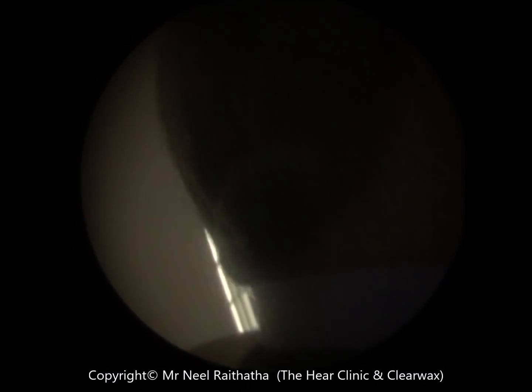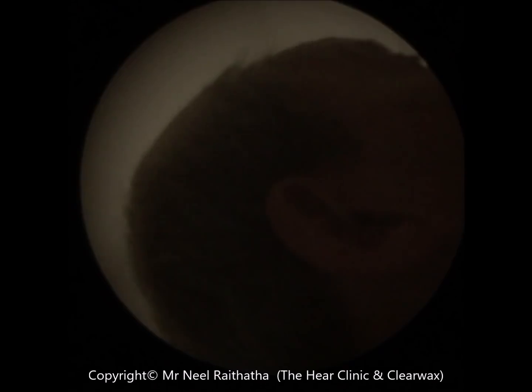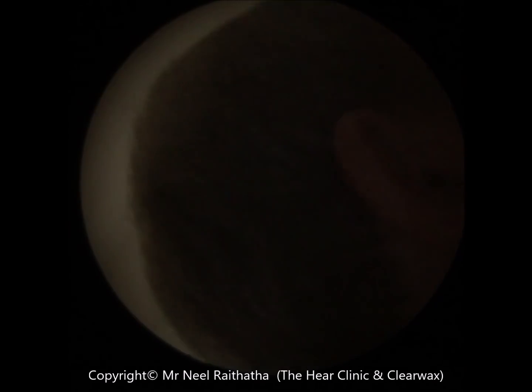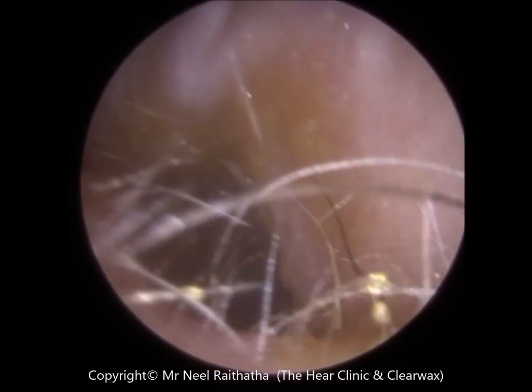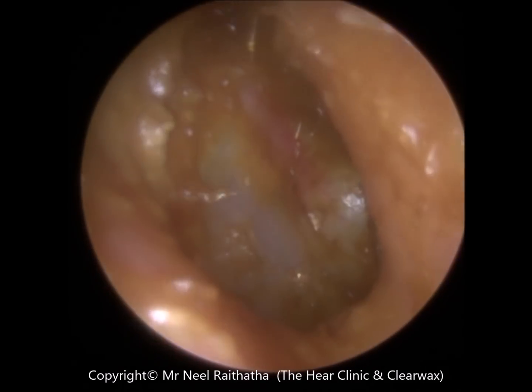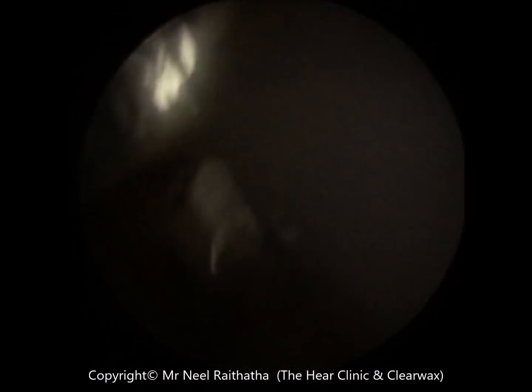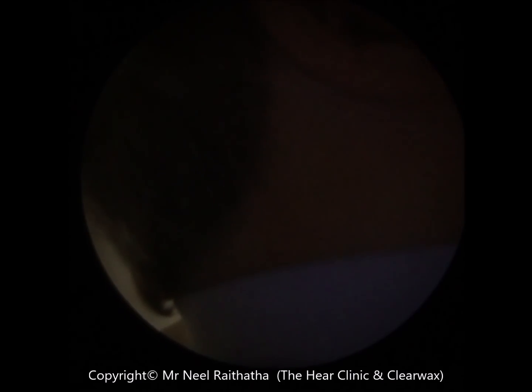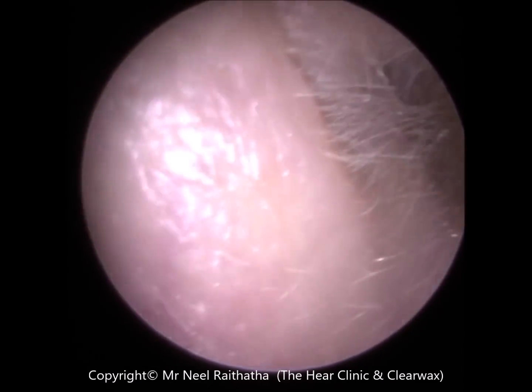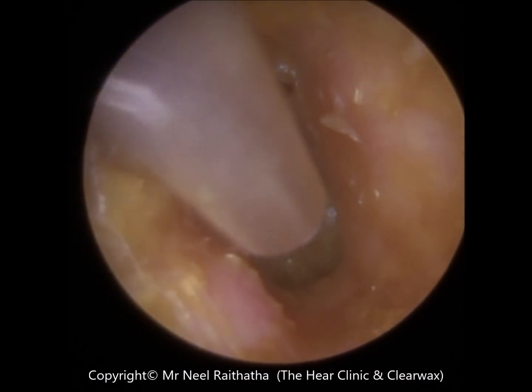Testing one, two. I can hear a lot better with this ear than the other one. It may not be just the wax. Let me just do a pressure test to see if there's a bit of negative pressure behind the eardrum. We'll try to get to the base of the eardrum. We don't want to cause you any pain, so we're not going to try anything that's going to be uncomfortable.